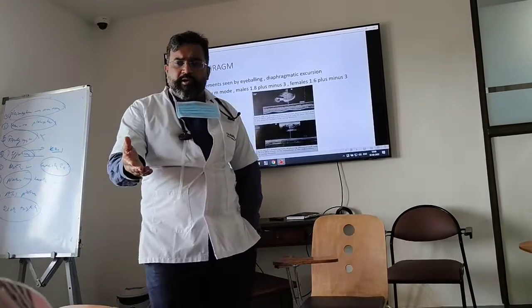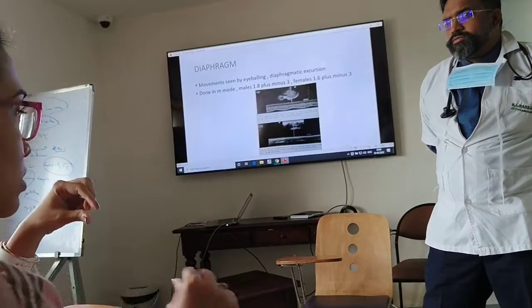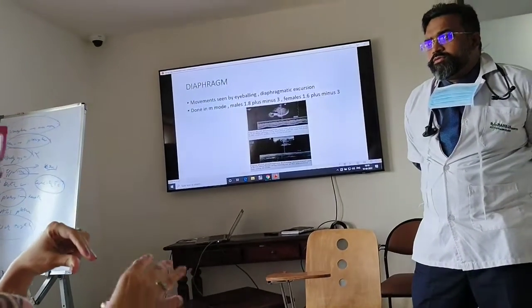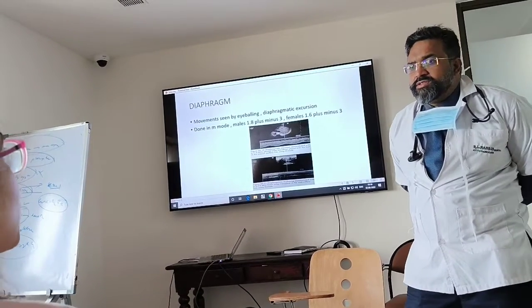So what have you done? Show me what you have done. So I saw the diaphragm. When I got the diaphragm, I froze it. This patient is on the ventilator, no? Yes. So you never do it with the patient on the ventilator.